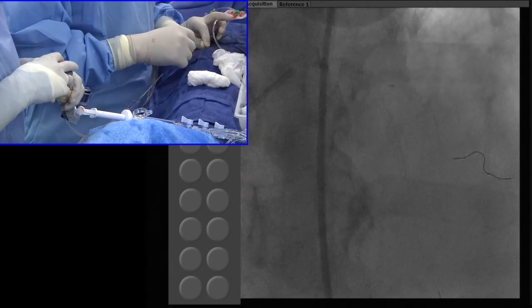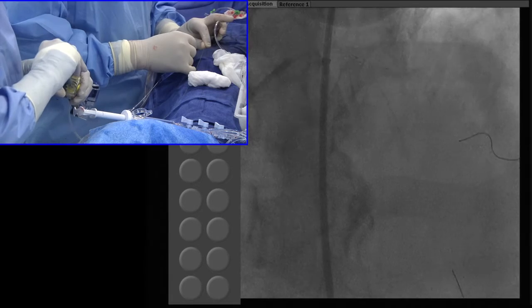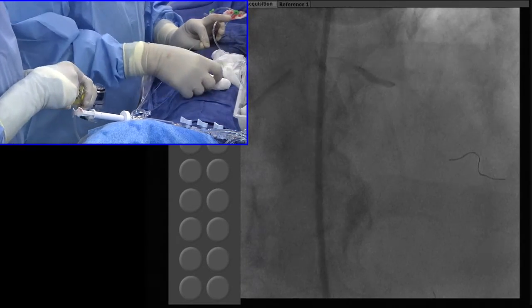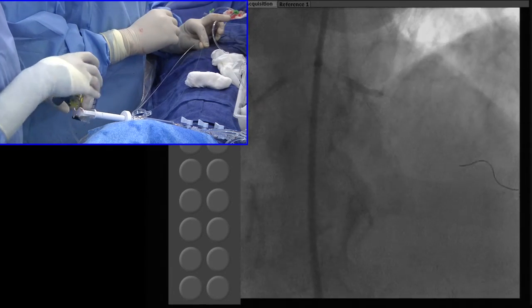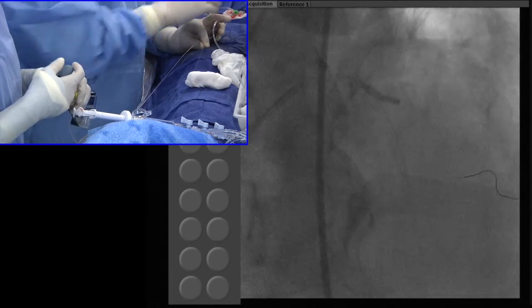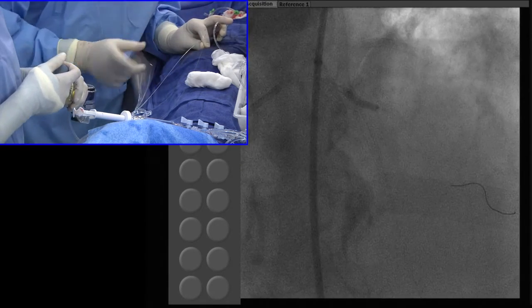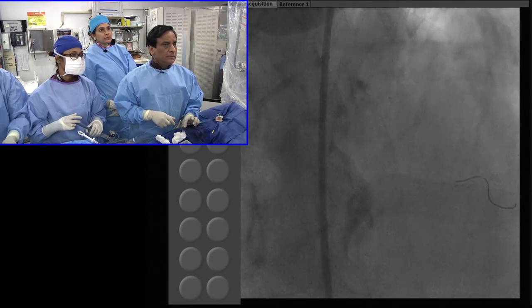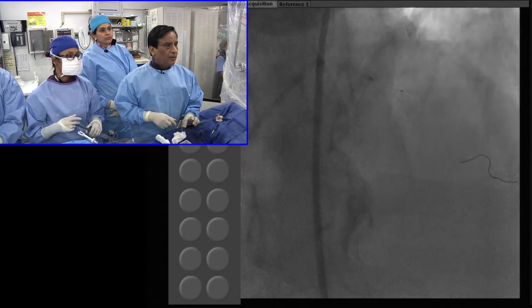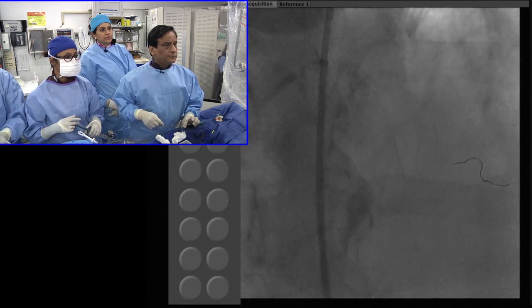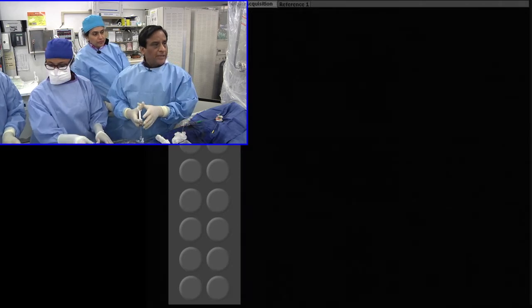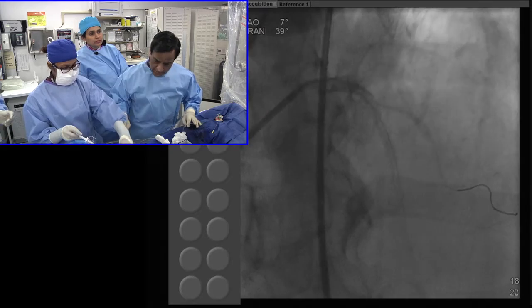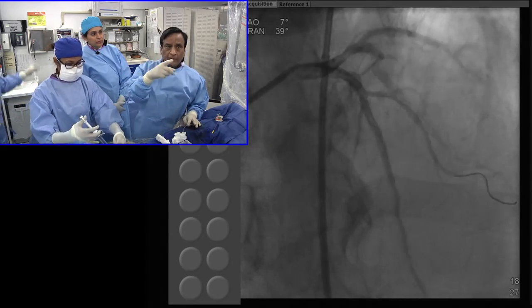Using a 2.5 balloon in the diagonal and a 3.0 to 3.25 by 30 high-pressure balloon. Patient pain will be okay in a few minutes. Patient definitely was having the pinch from the side branch — although EKG changes were not there. We will ask Dr. Keeney about what we saw. Side branch coming in very good — we can use the second balloon. Now you want to complete the OCT analysis. Show the OCT — that is the side branch. There is plaque shift and dissection. It is a combination — no dissection but plaque and stent struts across.